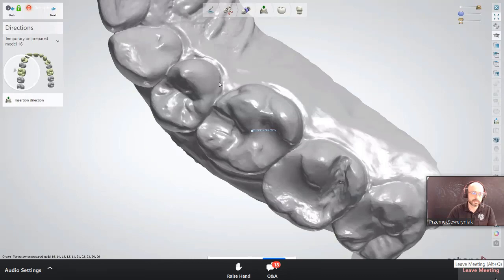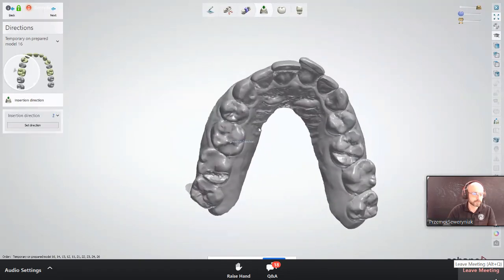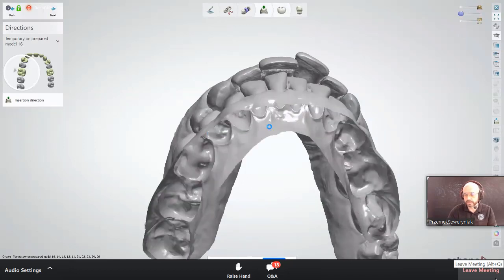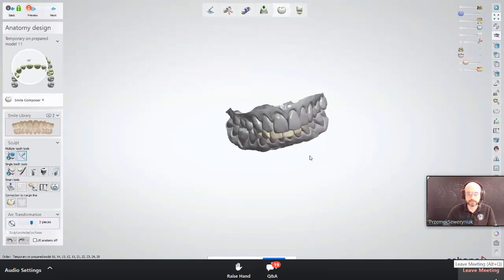If they send it like 3 days later, then it depends on how you choose to do the case in the lab, because normally we change order numbers and then Communicate fails to import the photos and we have to import manually. However, if you keep the original name that Communicate creates for you, then it's going to show up in the case later on as well, if you have the Communicate system linked to your dental software, of course.